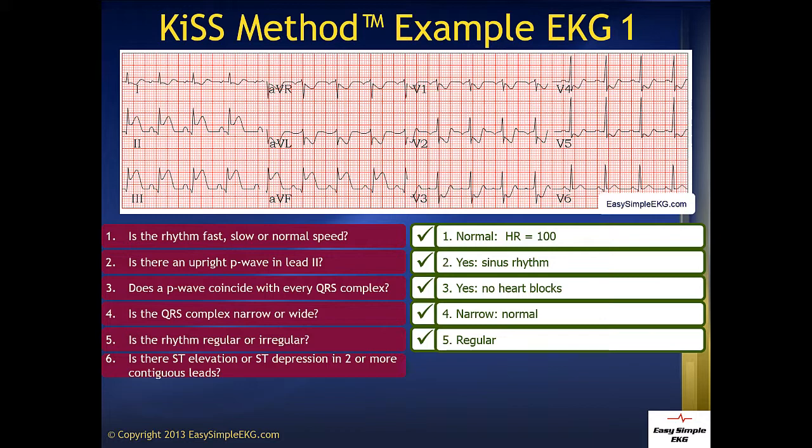We then go to leads V1, V2, V3, V4 — our anterior septal leads — and we see significant ST depression here. Of note, in lead V2 there is deep ST depression, which means an acute posterior wall infarct.